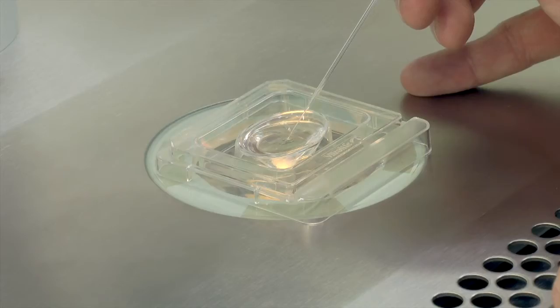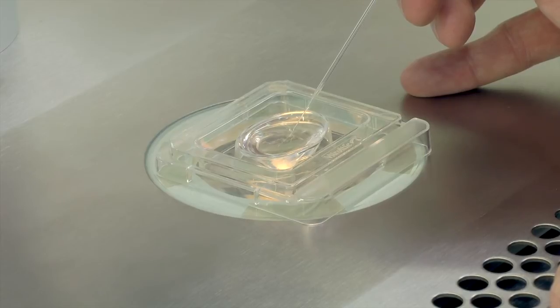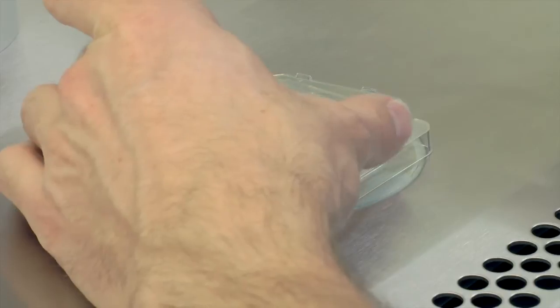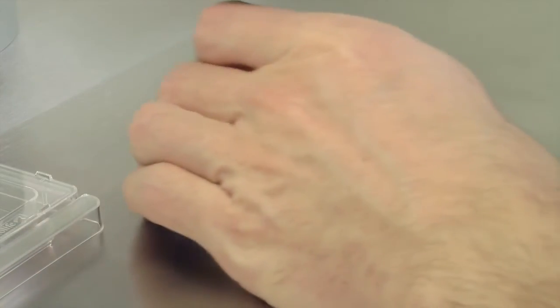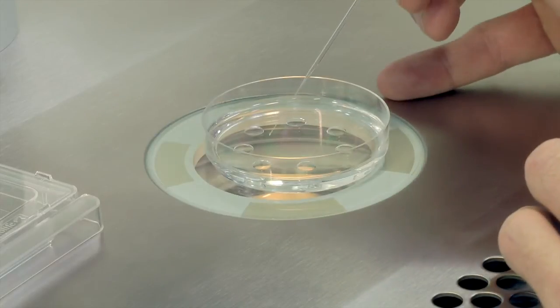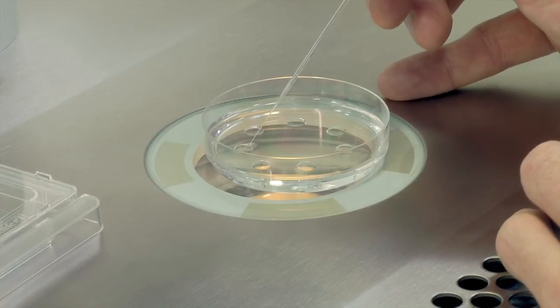At the time of fertilization check, denude the oocytes and assess them for fertilization in the GIVF Plus dish in which they were inseminated. However, if you know that this procedure will take longer than 2 minutes, we recommend that you use GMOPS Plus. This will allow for a much more stable environment for the zygotes and the oocytes to be assessed in. Remove the cumulus and the corona cells with a denudation pipette and assess them for fertilization at 37 degrees Celsius.